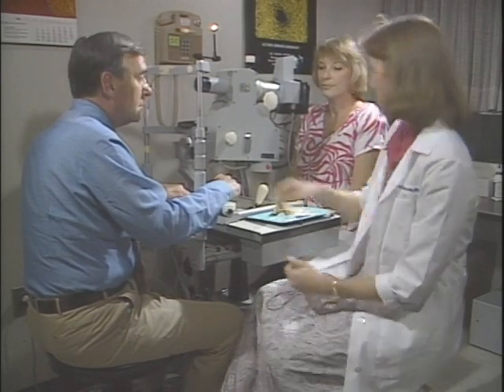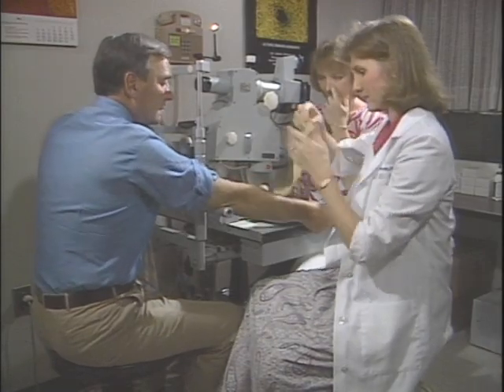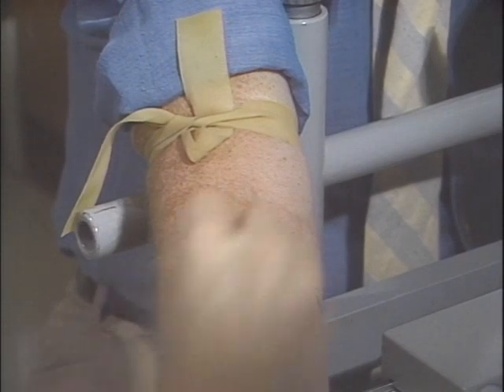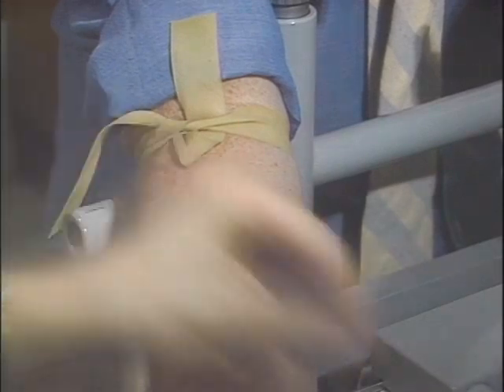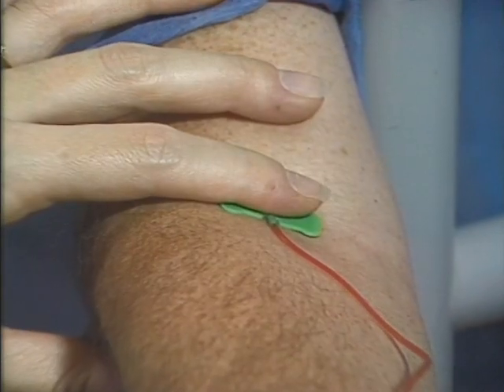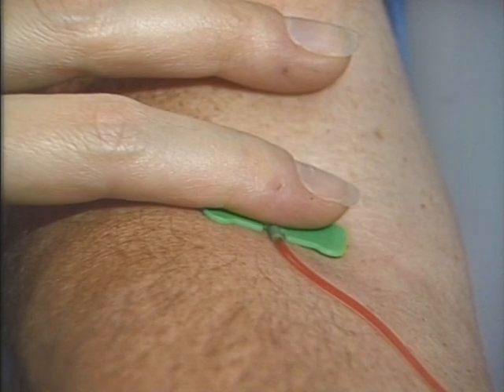No. You will then be given the injection of fluorescein dye by either your physician, a nurse, or a certified technician. I'm going to place a tourniquet in your upper arm. You have a good vein right there. I'm going to clean it off with a little bit of alcohol. I'm going to place this small needle — you'll feel a pin prick. Keep your chin in the chin rest. When I'm done, I'll bend your arm. If a small amount of the dye is released outside the vein in your arm, a temporary soreness or irritation may develop.